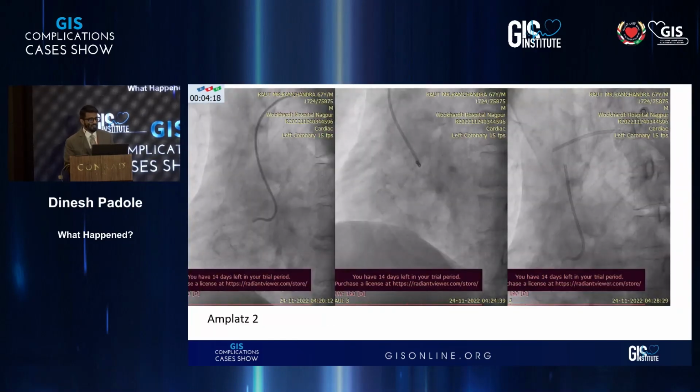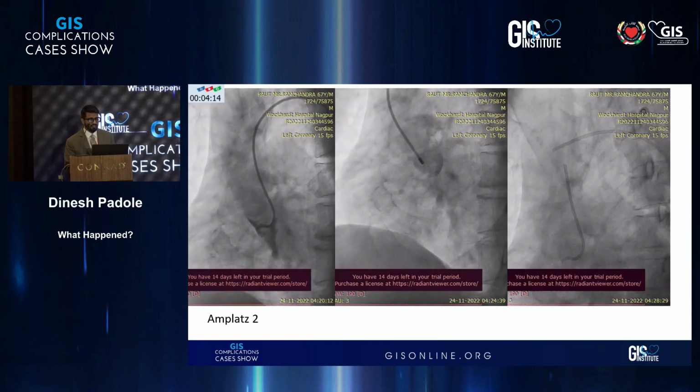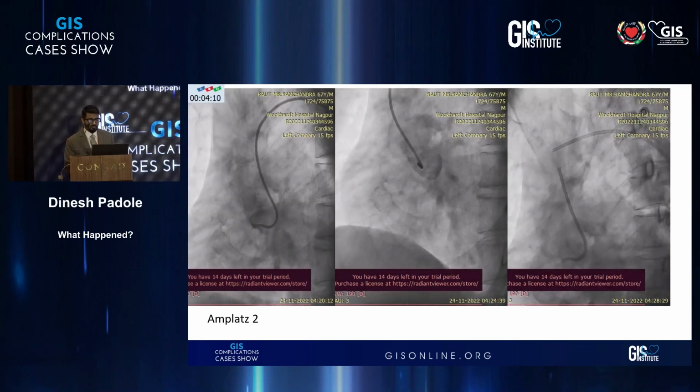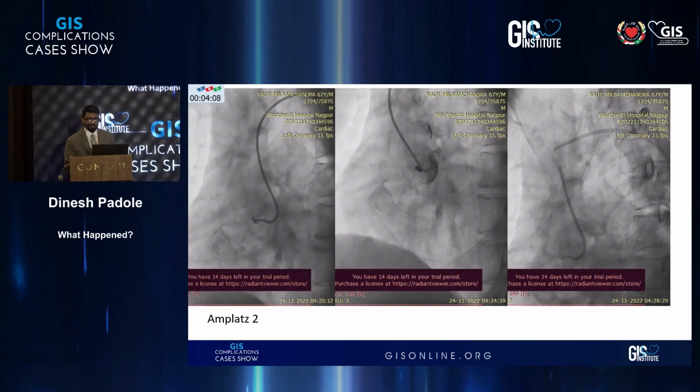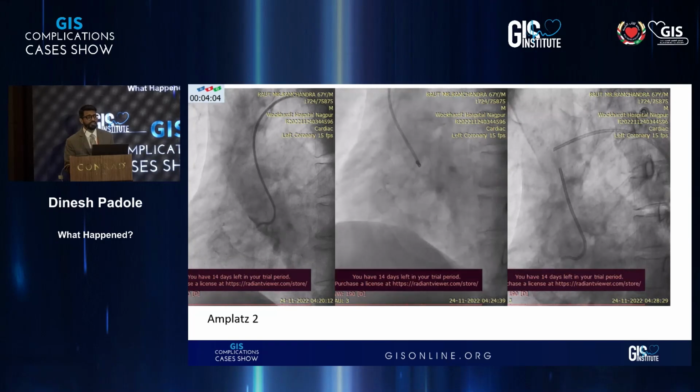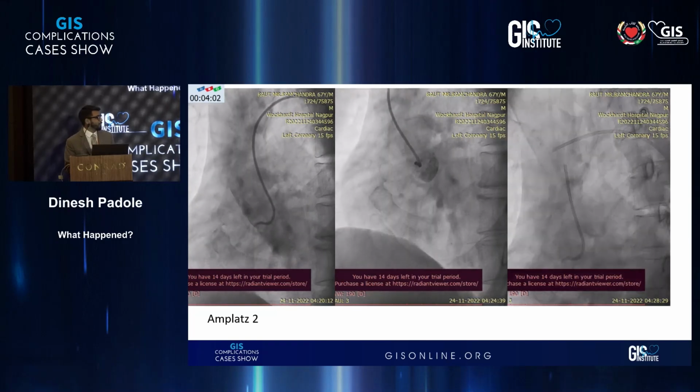Eventually took an AL, trying to find it, not getting it, and broke the catheter. And this is a new catheter, but it was on the shelf for a year. That was the issue. It's a new catheter.